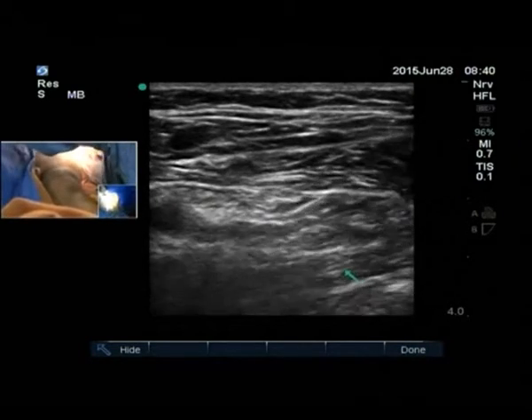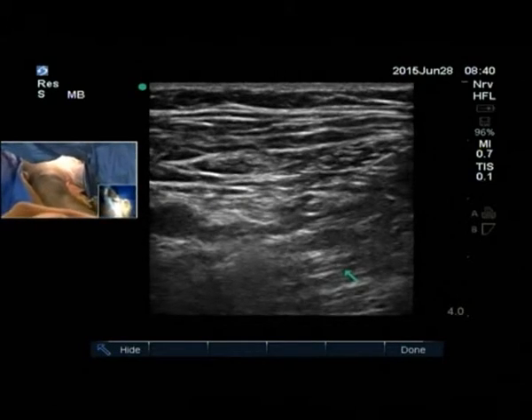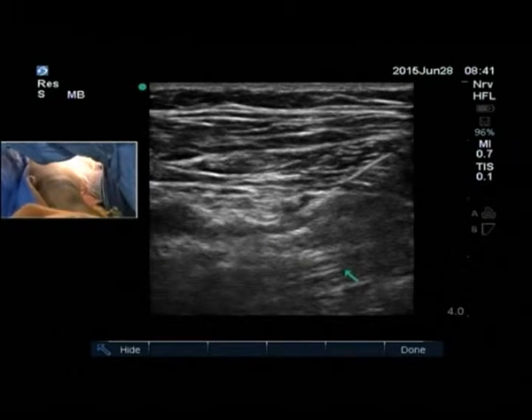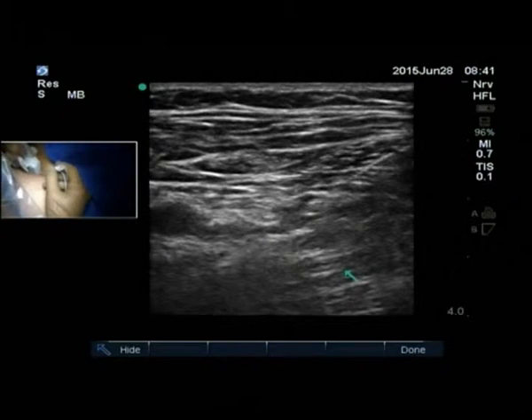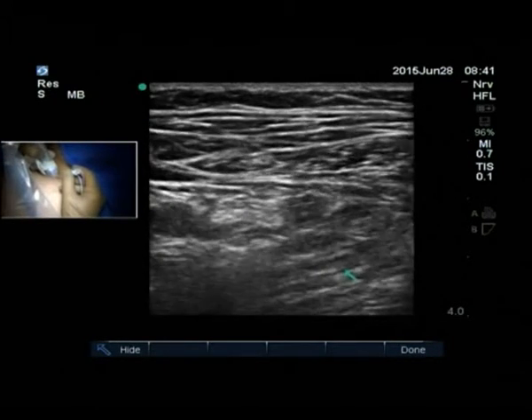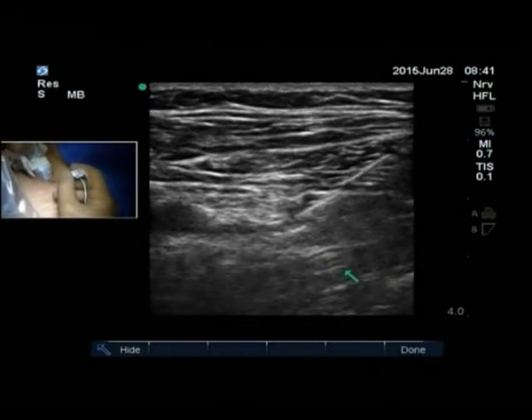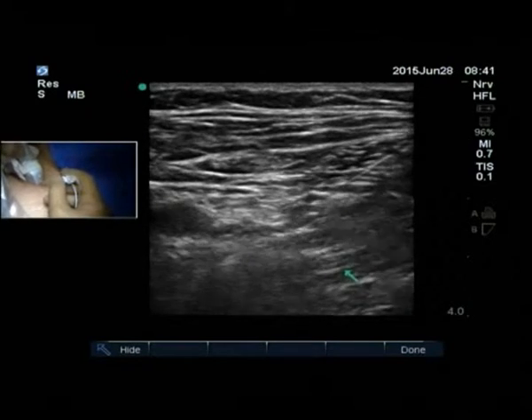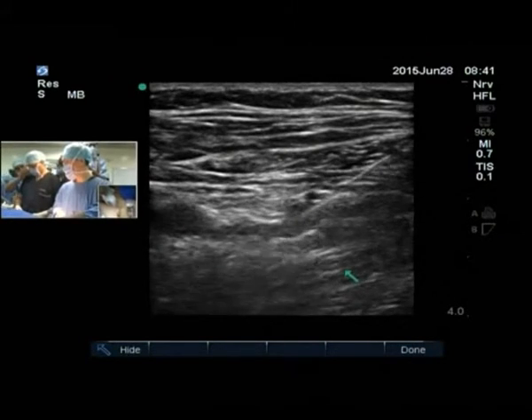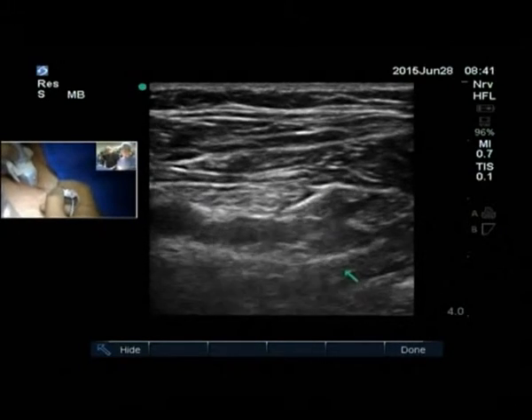So, are we going to do 3 blocks here? We are doing lateral femoral cutaneous, obturator, and femoral only. And this is for surgery. And what are we injecting here? 2% xylocaine with adrenaline, 10 cc. Now 2% lidocaine with epinephrine. This is bupivacaine 0.5%. This will be 10 ml. So we're planning to put in 10 mils of 0.5% bupivacaine with epinephrine to the femoral. So can we continue? Inject? Yes. It's very nice.